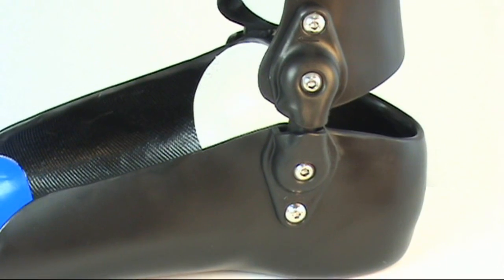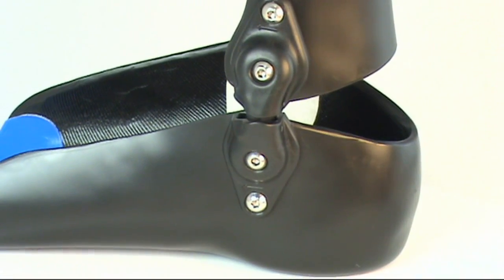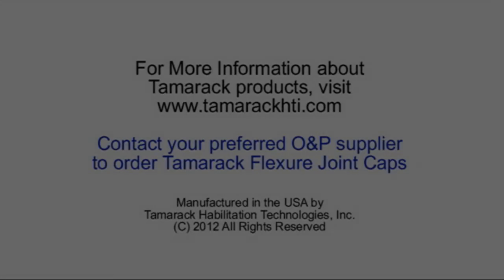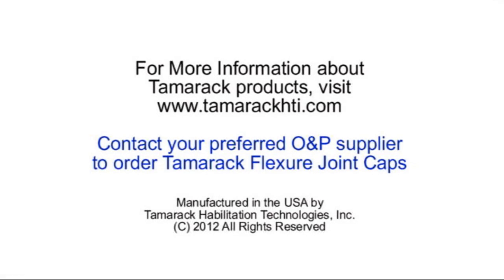Tamarack Flexure Joint Caps are the latest innovation in Flexure Joint Fabrication by Tamarack Habilitation Technologies. For more information about Tamarack Flexure Joint Caps or any product by Tamarack Habilitation Technologies, visit www.tamarackhti.com or contact your preferred O&P supplier.